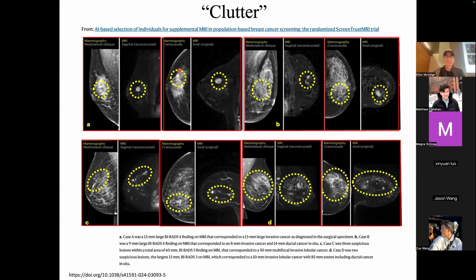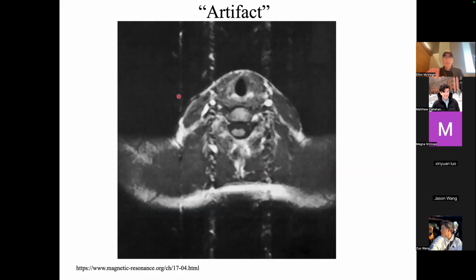Again, here's a mammogram. You say, well, this could probably be a lesion. Here's the lesion after a contrast injection on MRI. Okay. So MRI is spectacular at highlighting lesions in the breast. The issue is that you see this fantastically high contrast lesion, and a not small fraction of the time when you biopsy that thing, it's not malignant, it's benign. And so this is the problem. You find these lesions, go after them, biopsy them, but they're many times benign. So we'll look at statistical performance on using these things, using images as tests.